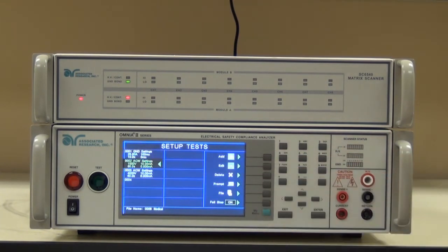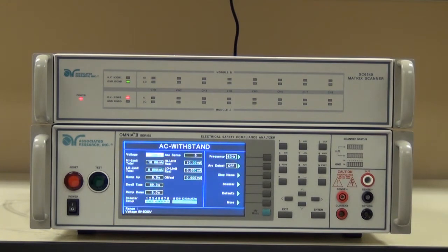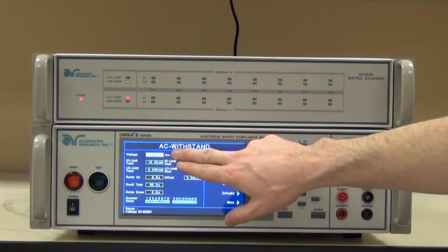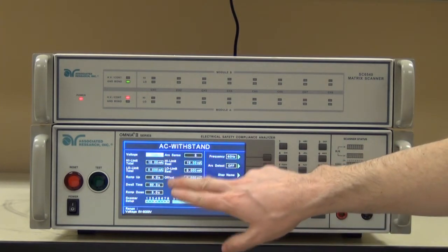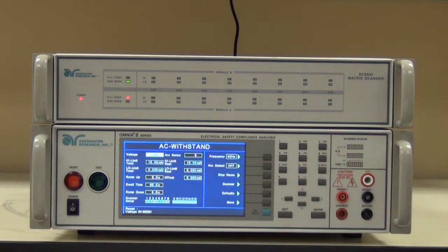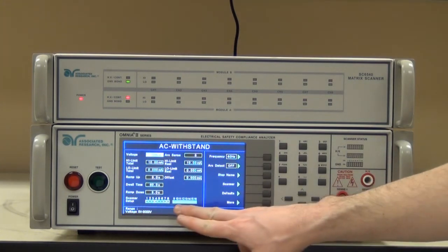For the first AC high pot test, it's going to test from line neutral shorted, or mains, back to the chassis point. It's a simple 1500 volt test with a 10 milliamp high limit, a 5 second ramp up, a 60 second dwell, and a 5 second ramp down. Since I'm using the adapter box and just testing the mains, I don't need to set any scanner channels as of yet.